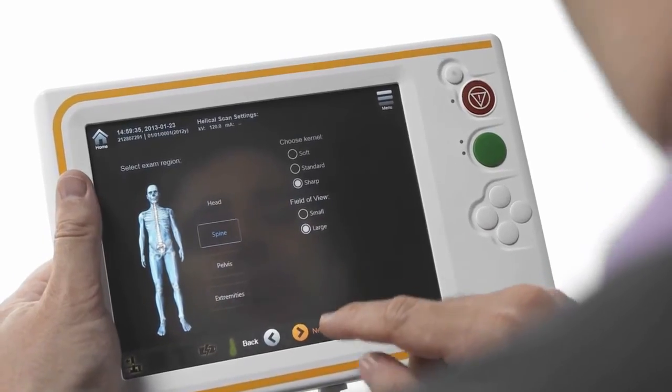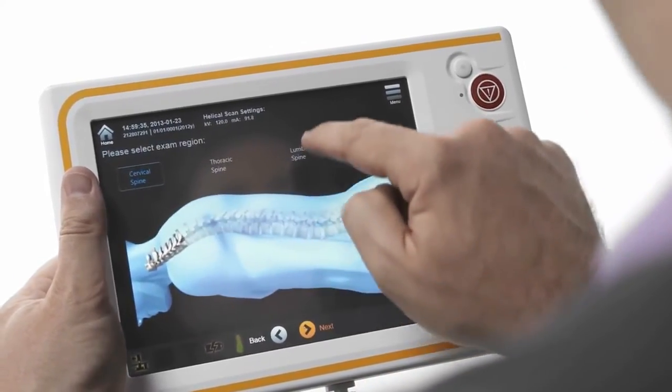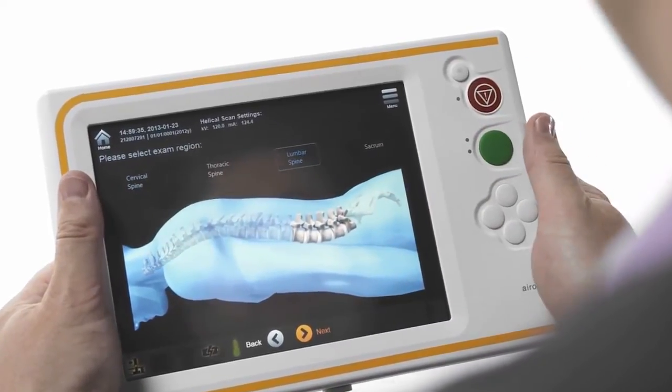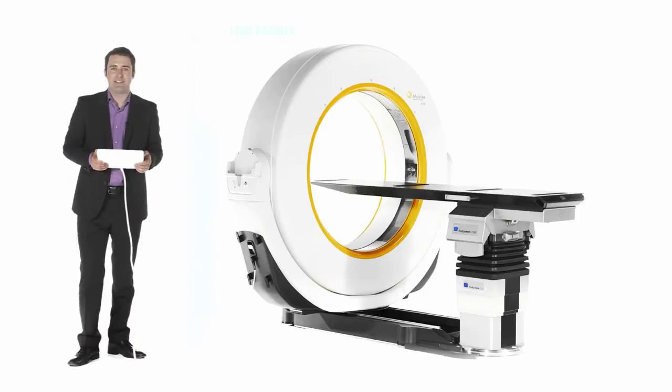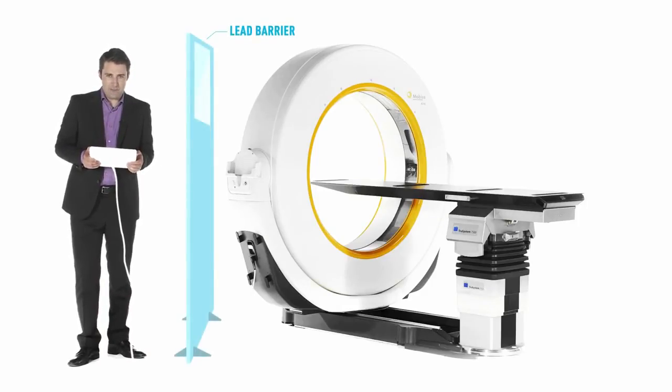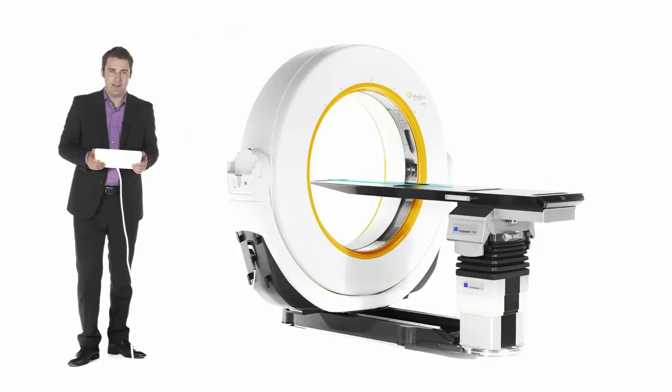After an initial low-dose scout scan, a 3D scan range can be defined. The 32-slice detector array of Aero provides detailed anatomical context for clinical decision-making. Acquired in helical mode with 1mm slice thickness, the scan volume can be set to a maximum of 100cm in length and 50cm in diameter.